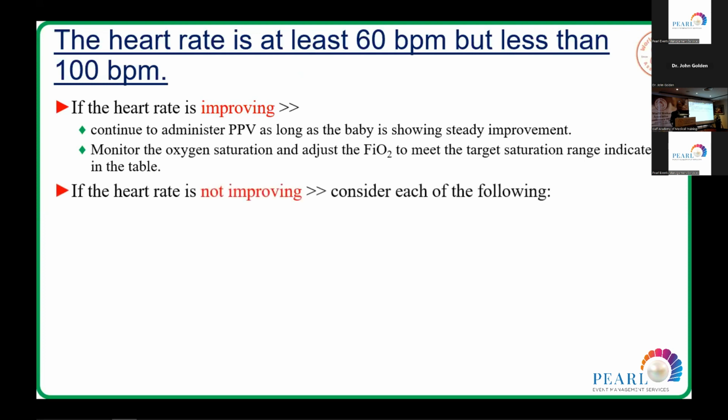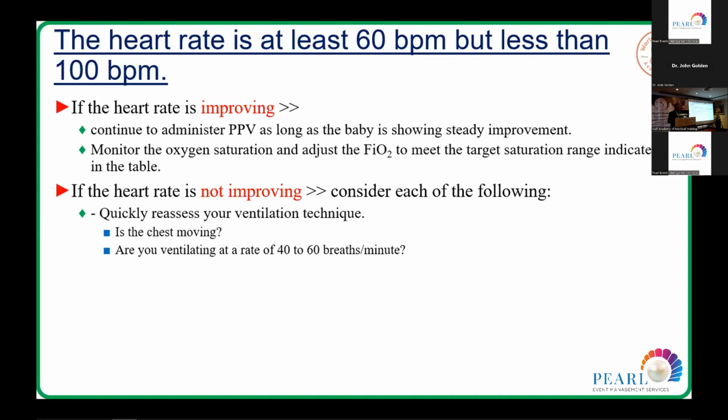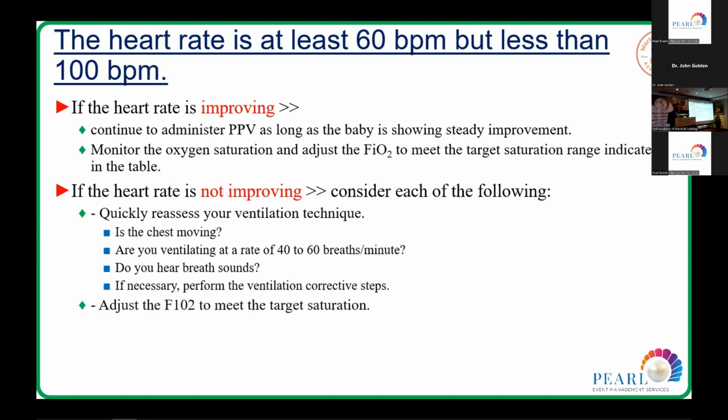If the heart rate is not improving, consider each of the following. Quickly reassess your ventilation technique. Is the chest moving? Are you ventilating at a rate of 40 to 60 breaths per minute? Do you hear breath sounds? If necessary, perform the ventilation corrective steps. Adjust FiO2 to meet the target saturation.